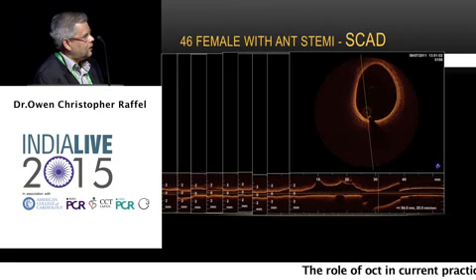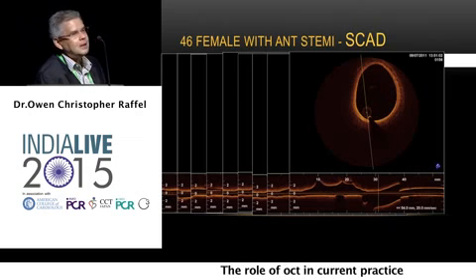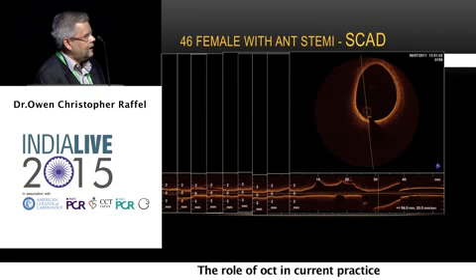Very nice hematoma from the dissection, a little proximal flap. And just proximal to that, you can see actually where contrast has leaked in to that space and usually causes staining on the vessel. So nice, unambiguous pictures to make a diagnosis of SCAD. And in fact, that's the LAD coming into the circumflex and left main. And that's the left main.